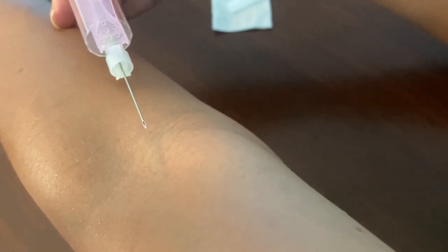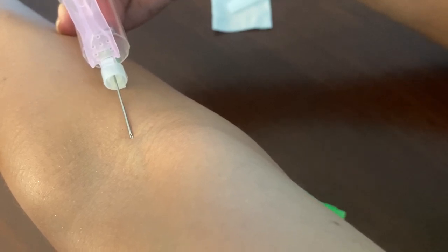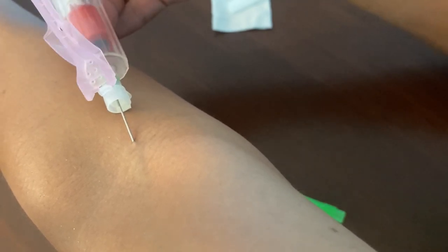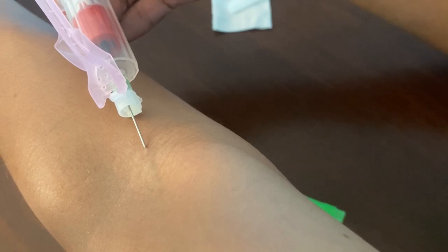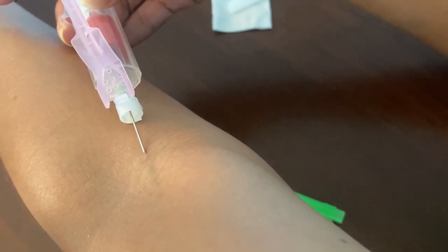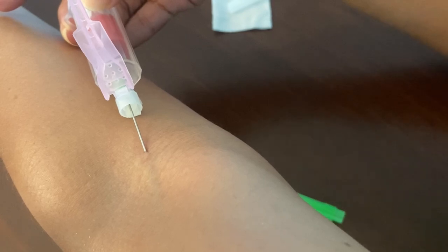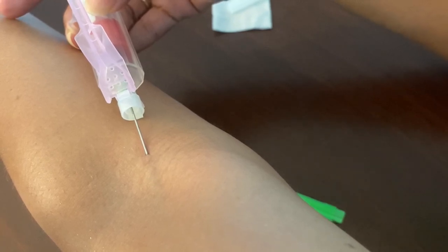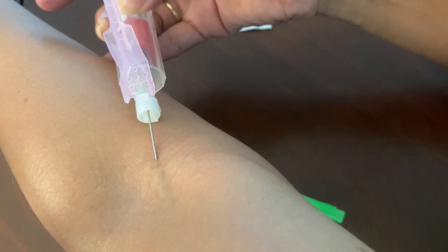Bevel is up, needle is ready, as well as this vein. I'm going to puncture this vein and I want you guys to look at how easy it is to redirect. Once you puncture the vein — voila, right here. I know I'm in this vein. But for whatever reason, just for the sake of showing you this hack — when you don't get blood, what you want to do first is pull back slowly. Blood should flow into your tube. If it does not, to avoid having the patient look at you crazy, talk to your patient while you gently move over to the left.